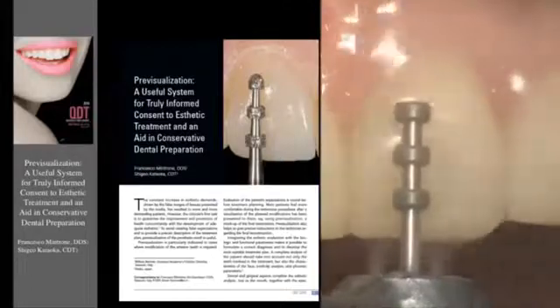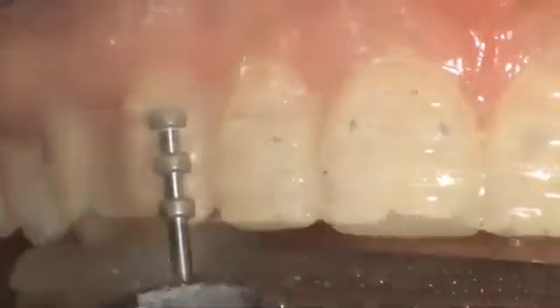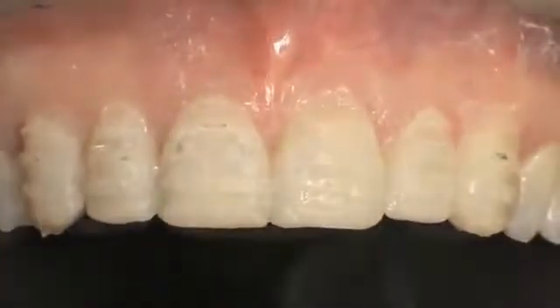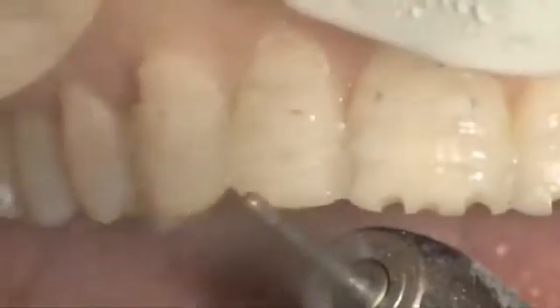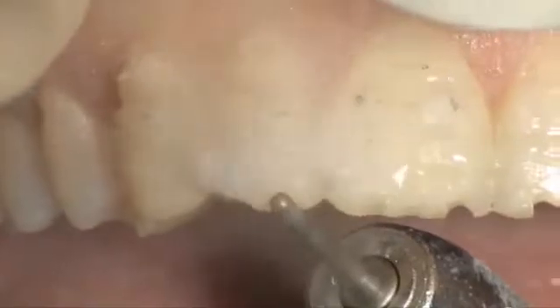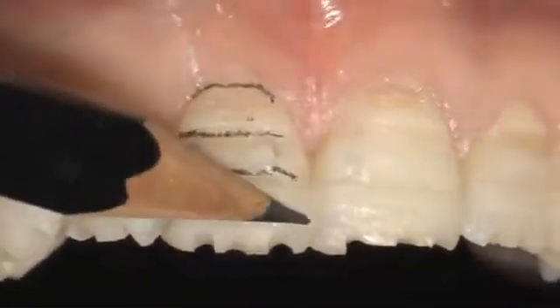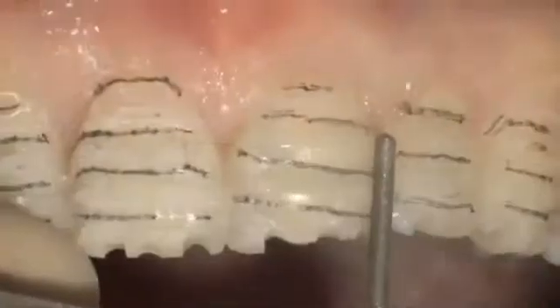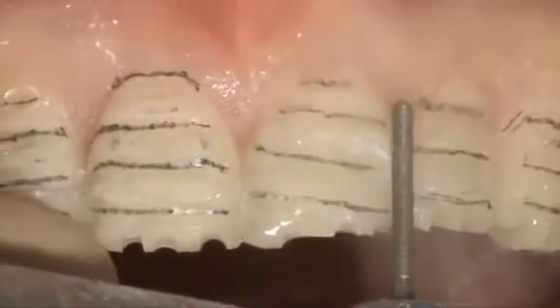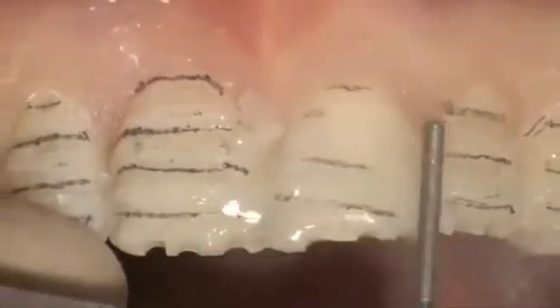The preparation starts with the use of calibrated burs to make deep cuts, which guide the axial preparation. The use of calibrated burs allows a precise reduction, which is necessary for the technician to fabricate a well-designed final restoration. Previsualization allows the proper use of calibrated burs since the reduction follows the new contour and shape of the teeth, avoiding in this way a too aggressive preparation.